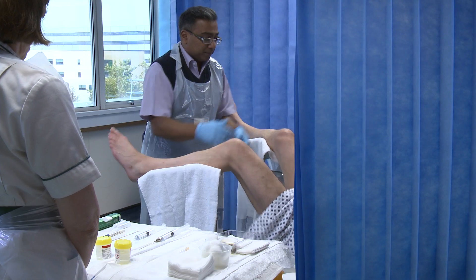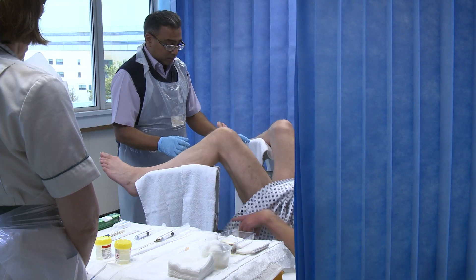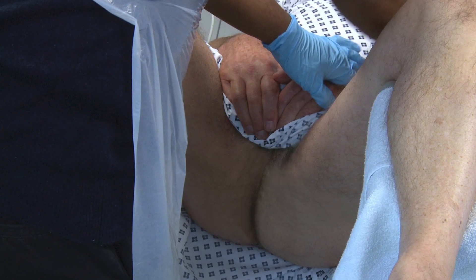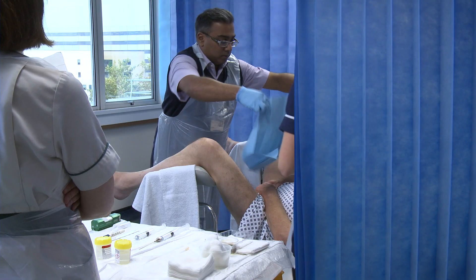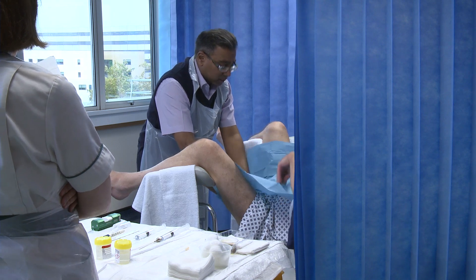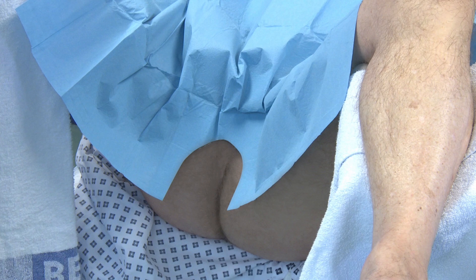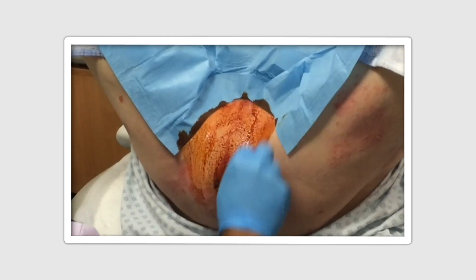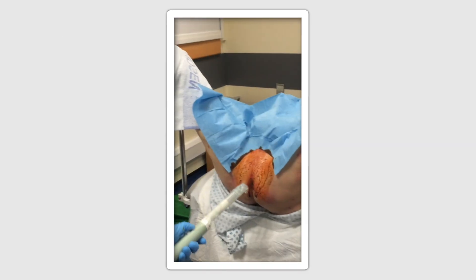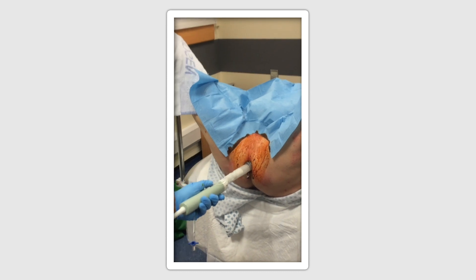The position is standard lithotomy with no extension required. Patients are asked to hold the external genitalia up onto the abdomen with a slight degree of tension, and a sterile drape is placed over the lower abdomen and, if necessary, separate drapes over the thighs. The perineal area is thus exposed ready for the procedure. The area is prepared with antiseptic wash, and a preliminary scan is performed using the linear transducer probe inserted into the rectum to visualise the prostate gland and the depth from the perineal surface.